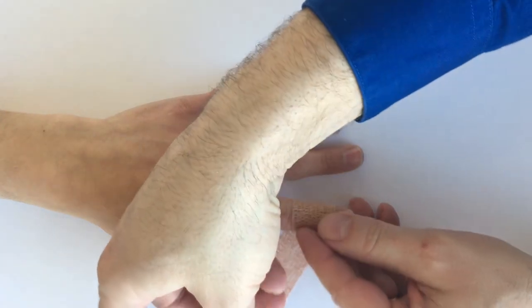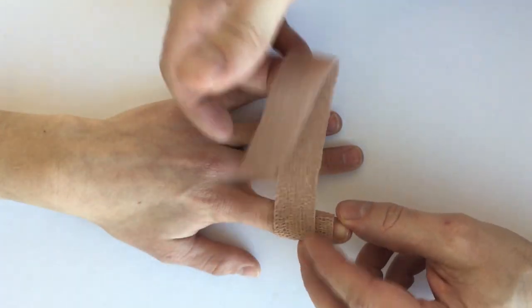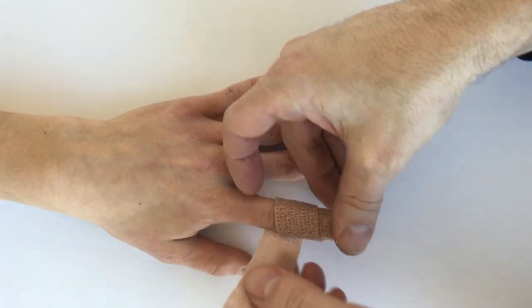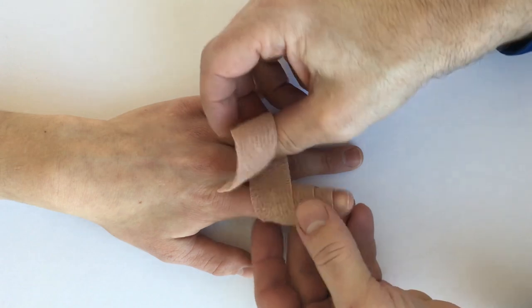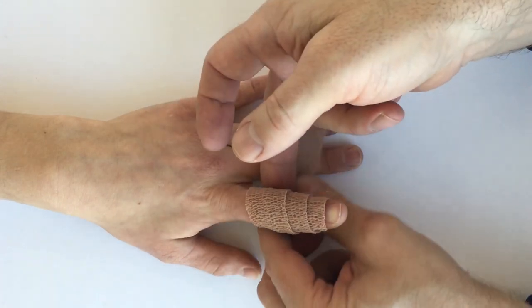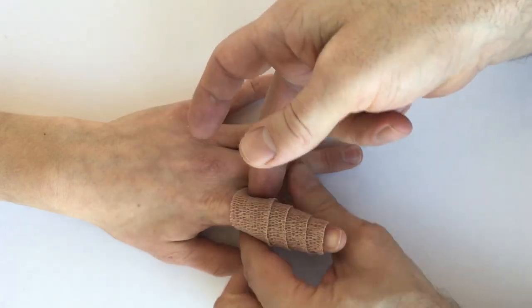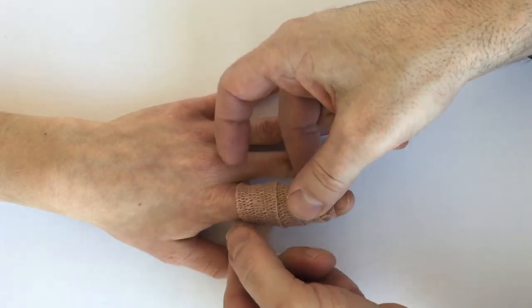When you wrap the Coban, just lay it on there without any stretch. The Coban will tighten up on its own once it's been on there, and you just keep going around overlapping by half each time until you have the whole finger wrapped.